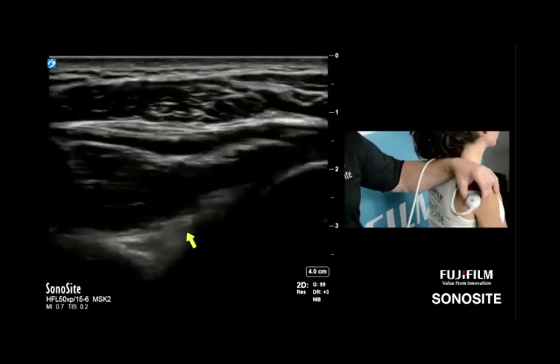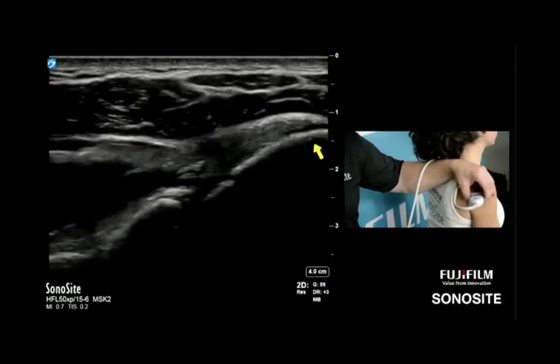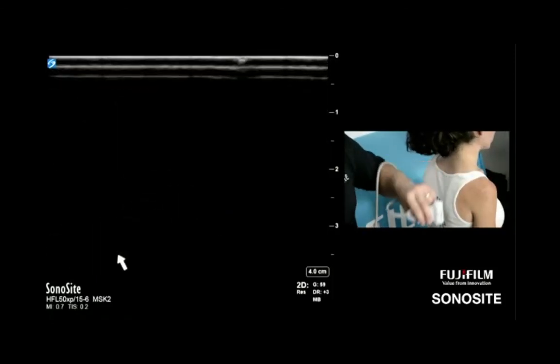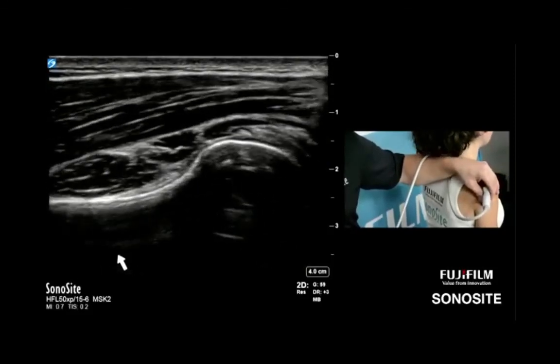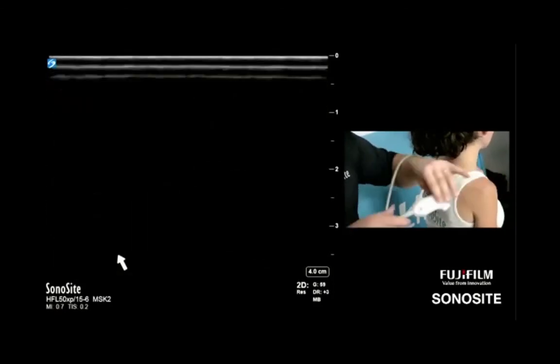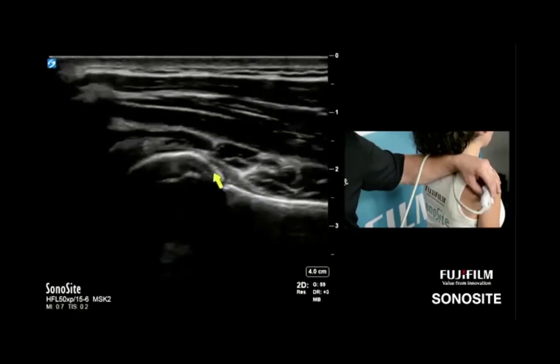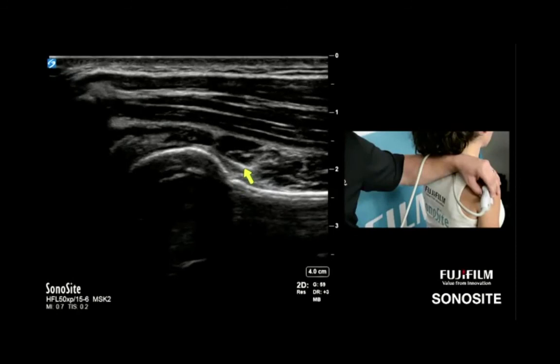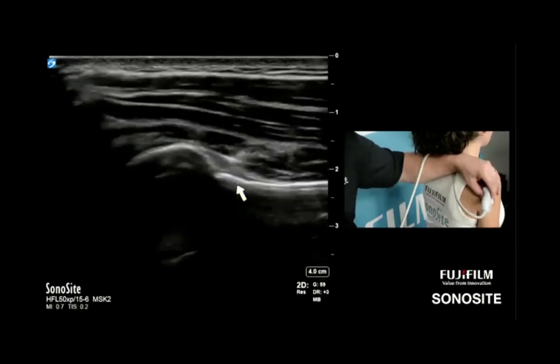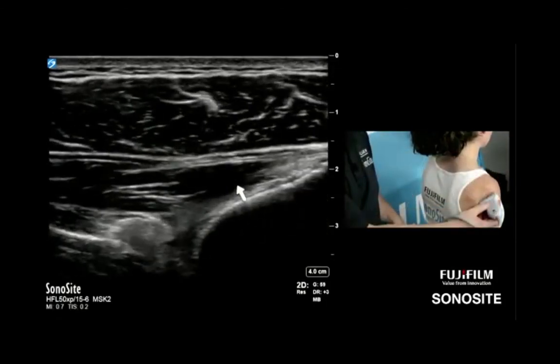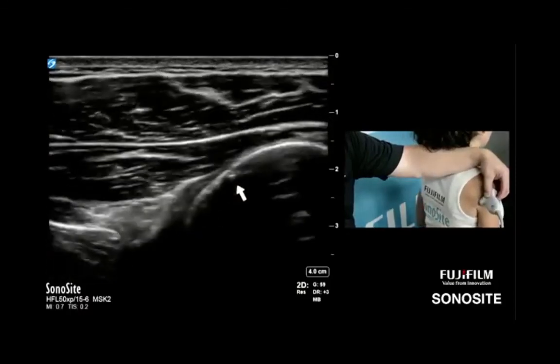You can even see the infraspinatus showing its enthesis here. Externally rotating, you see the complete fibers across the enthesis of the infraspinatus. For the teres minor: go find the posterior humeral head and neck junction — it looks just like a hip head-neck junction. Here's the infraspinatus, and all of this muscle below is the teres minor, with its central tendon right there on the neck. Pointing the beam from inferior to superior gives a nice 90-degree slice through the teres minor into the humeral head. Rotate the transducer for that upward angle to get a really nice view of that central tendon. If you have questions about this webinar, see Bill and Daniel's contact information on screen — feel free to email them. Thank you for joining us.